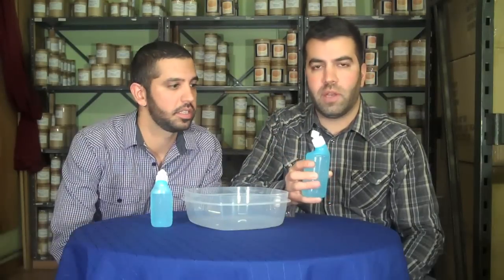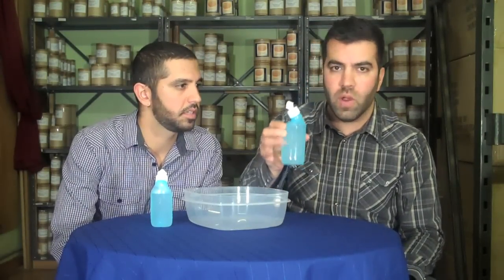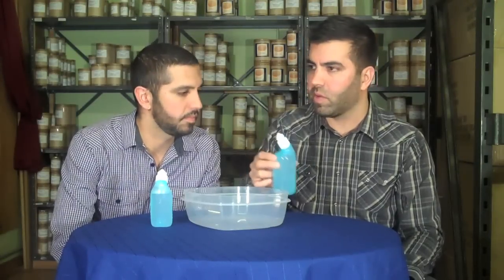Hey guys, it's Q Brothers and we're here to talk about Nasopure. Nasopure is a sort of updated version of the neti pot. The neti pot is designed to help you wash your sinuses. We thought we'd talk about a few things that make Nasopure a little bit different and why we've started using it personally — just give you a review on Nasopure.